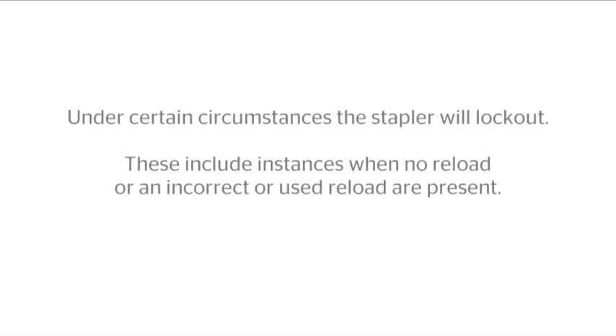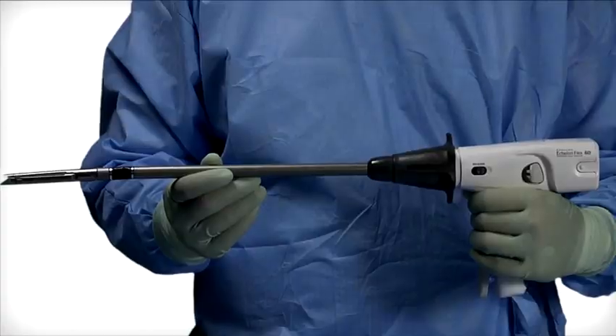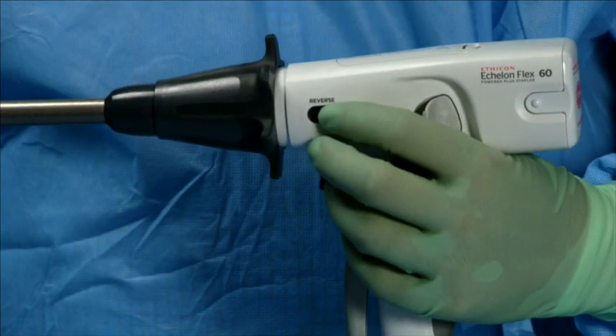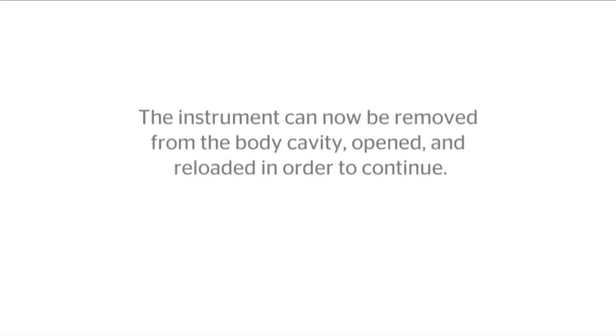Stapler lockout. Under certain circumstances the stapler will lock out, including instances when no reload or an incorrect or used reload are present. When the instrument locks out, the motor stops. Release the firing trigger and slide the knife reverse switch forward to return the knife to the home position. The instrument can now be removed from the body cavity, opened, and reloaded in order to continue.